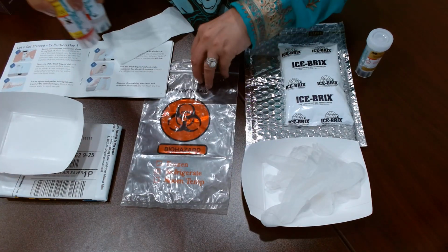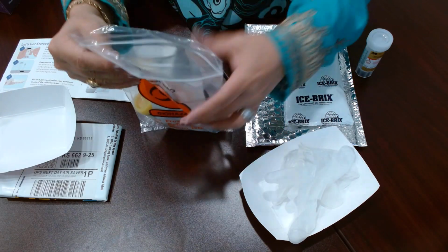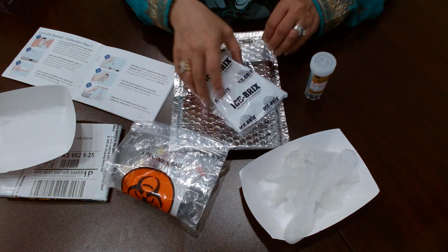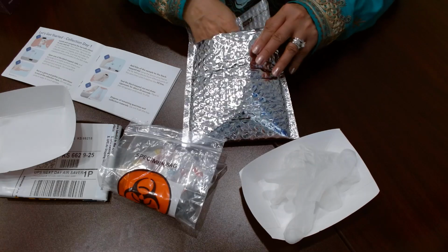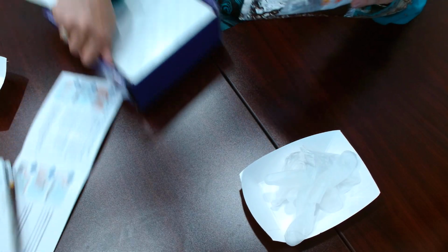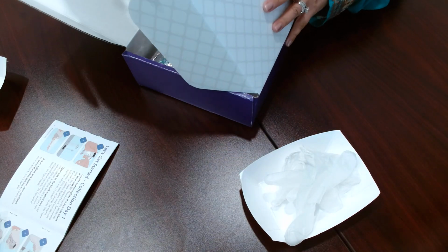We recommend that you put the vials inside this biohazard bag after collection of the stool sample. You always put in this blotting paper, called the desiccant paper, which absorbs the moisture, remove all the air out, and seal it tightly. This should be in the fridge. This is the second sample. For the first sample, after the ice is frozen, you put it in here and put this next to it. It's all frozen, and then you seal it like this. Now these two samples are going to go inside this box like this, and now you're going to close it.